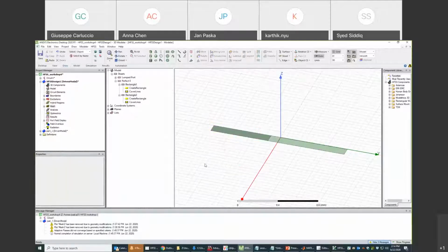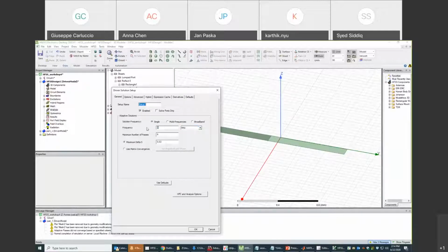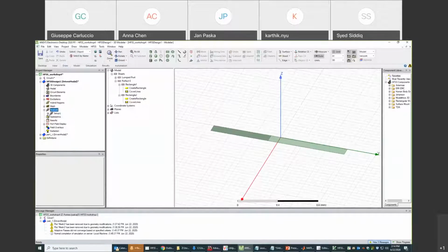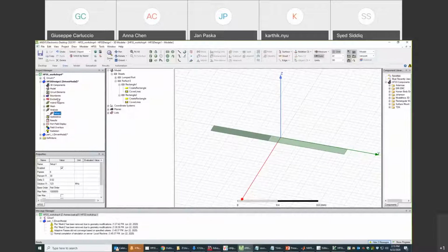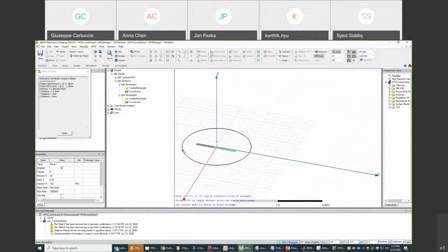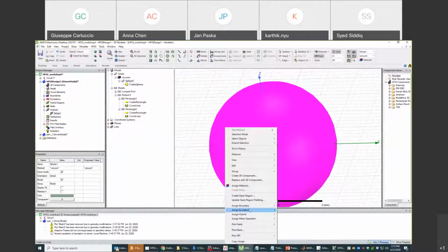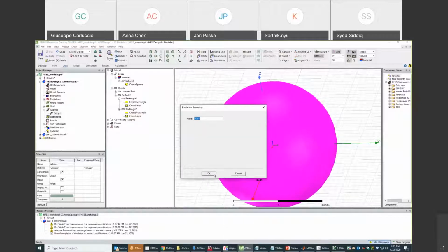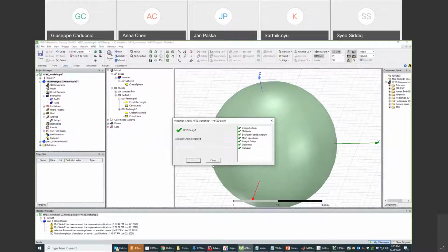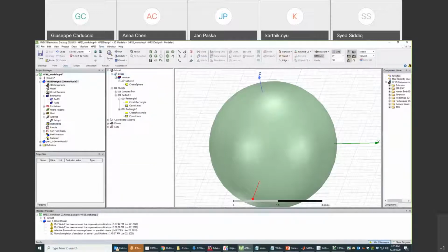My PC is a bit stuck right now. So we can assign an analysis solution setup. Can delete this. So yeah, we set up a whole simulation. Now maybe let's just quickly do the radiation boundary. Quickly a validation check. Okay. So we designed this whole model, and now I can say tools, stop script recording.